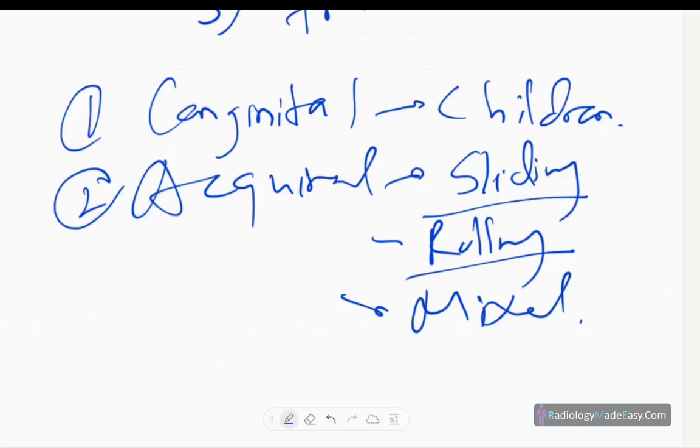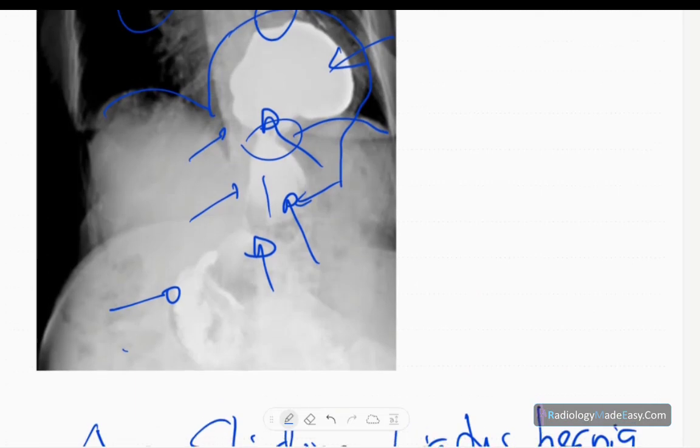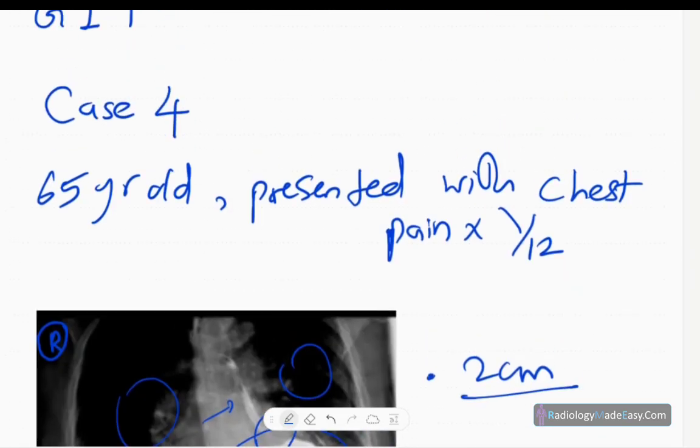Rolling hernias are actually para-esophageal hernias where the gastroesophageal junction is at the normal position and the fundus is rolled out into the thorax. As in this case, you have to exclude any gastric volvulus. You can see the greater curve here, so there's no organ-axial type gastric volvulus. That's important as it's a surgical emergency. That concludes case number four in GIT contrast studies.